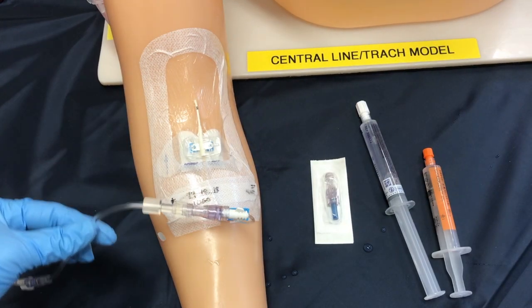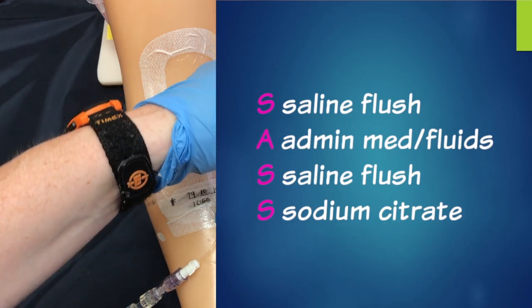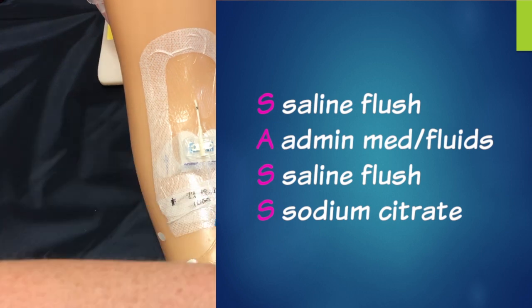Now the infusion is complete and we're going to continue on with our acronym of SAS or SASH. We've completed the first two steps — we did a saline flush and we administered our medications. Now we're going to continue with a second saline flush and a sodium citrate to lock off the line.